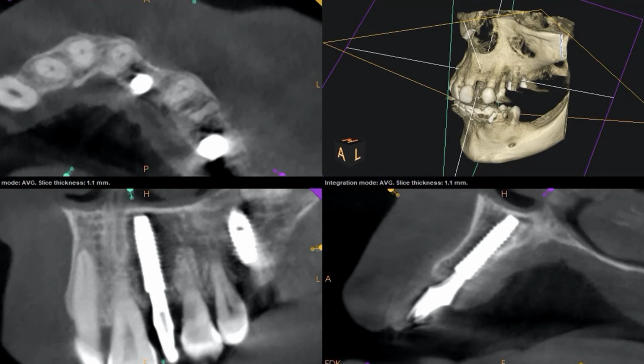It's a little bit thinner on the lingual, and I would always prefer it that way. If I had to pick the buccal plate or the lingual plate to be a little thin, I'd always want it to be the lingual plate. So I'm glad that we have a lot of robust bone on the front of our implant. I'm glad that the apical end of our implant engages just barely the floor of the nose, so that cortical bone is providing strength. It's positioned beautifully parallel relative to the other roots. Overall, the position of the implant in the bone I'm happy with. There's certainly more bone on the lingual of that implant than I think the CT makes it look like, however.